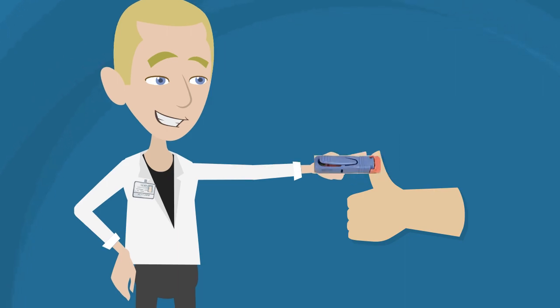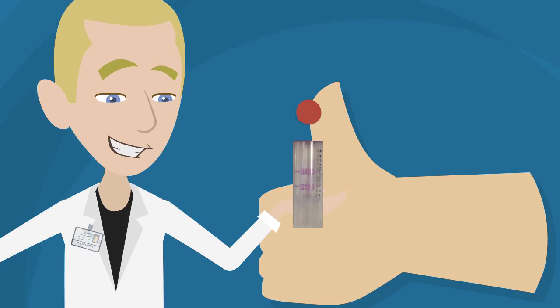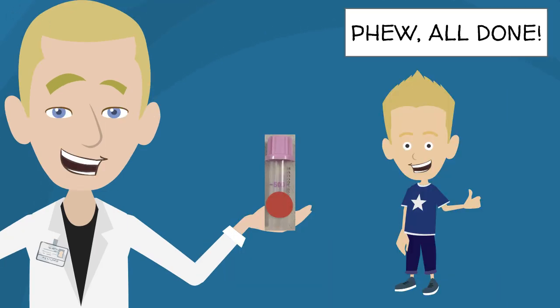I then use one of these clickers to get a few drops of blood and put them into a bottle. That's it, all finished.